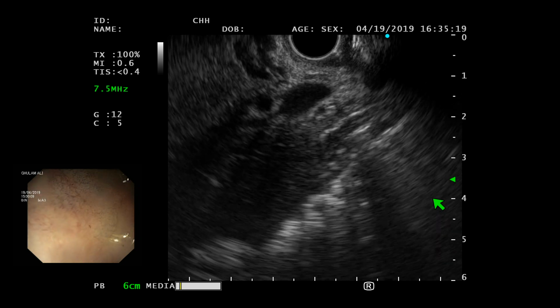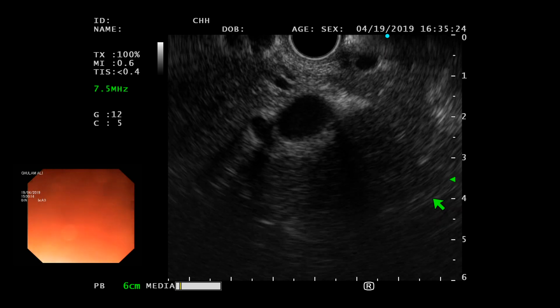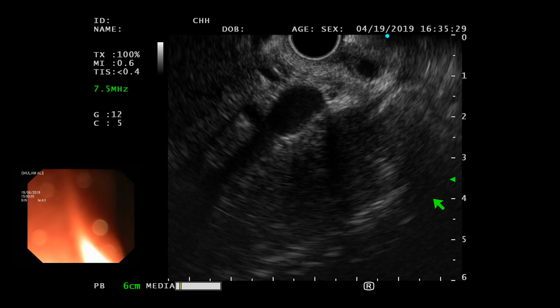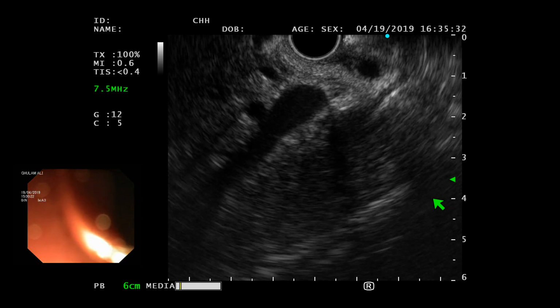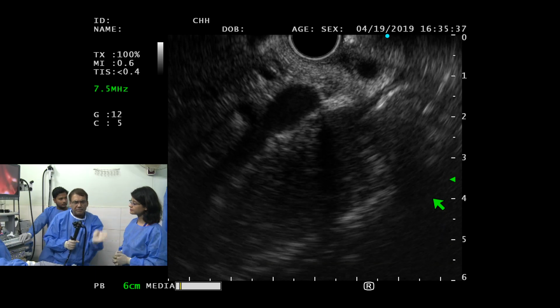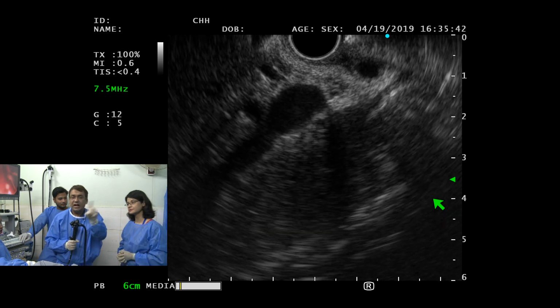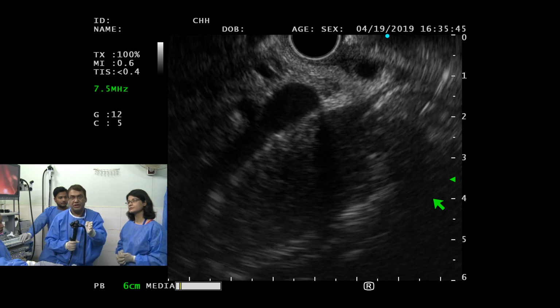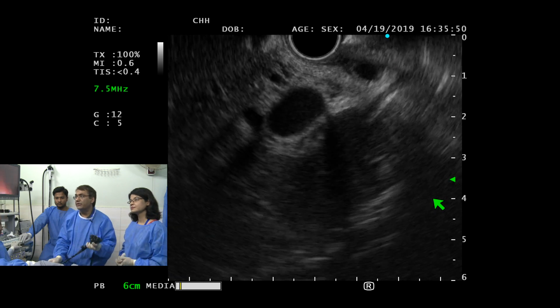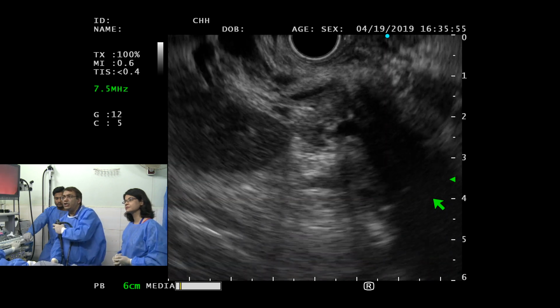Khalid, you said acute change. What acute change is there? These are necrosis, and so what you look for in acute changes is how much edema is there, okay? And edema is gonna give a rough surface around the pancreas. It's what we call spiculations. It's not speculation, it's spiculations, S-P-I-C-U. And let me show you the spiculations. Those are the findings which tell you that there are acute changes.